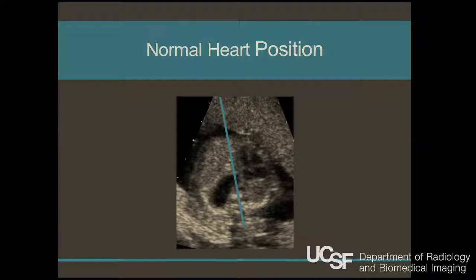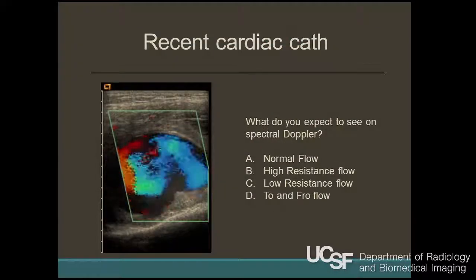And just as a caveat, if you do look at the 4-chamber view of the heart, make sure there's actually 4 chambers. Don't just assume there were because the tech took a picture and labeled it 4-chamber. Really go through the process, make sure there are 4 chambers, and we can go over that a little more later.